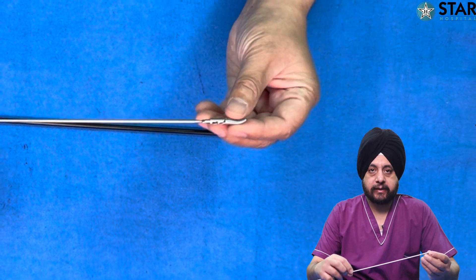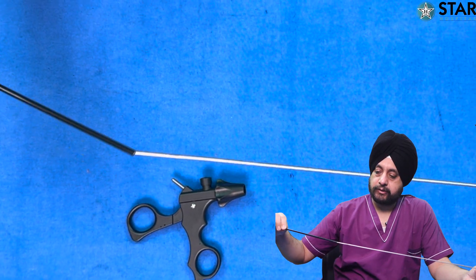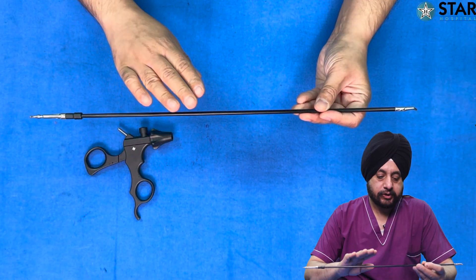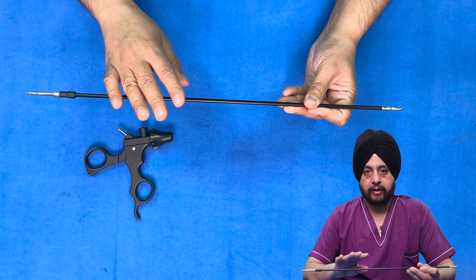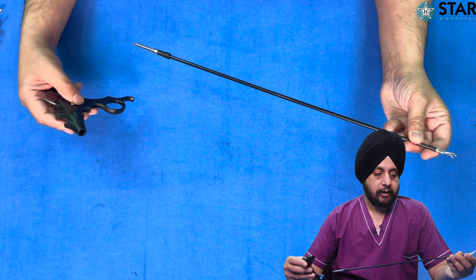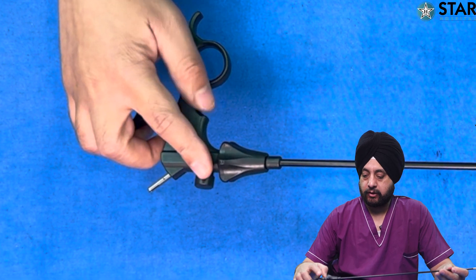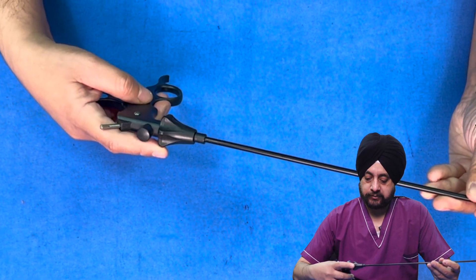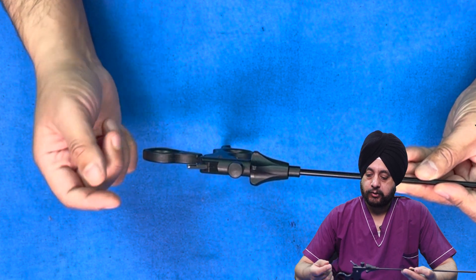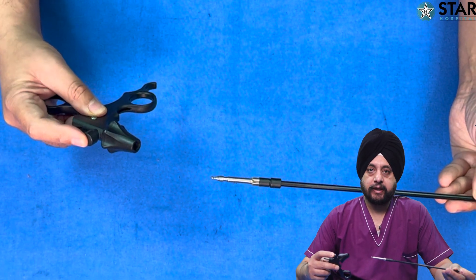The insert has a specific tip — these tips are meant for different functions. This one here is called a Maryland forceps. You insert this into the sheath, which is why it is known as the insert part and this is the sheath part. The metallic part will conduct electric current but the insulated part will not, shielding adjacent organs to avoid any inadvertent injury. To insert the handle, in this model you open the grips, push it, and then close the grip — that engages the instrument and locks it. This part is for rotation so you can get a proper angle on your tissue. This part here is for attachment of the electric monopolar cautery cable.